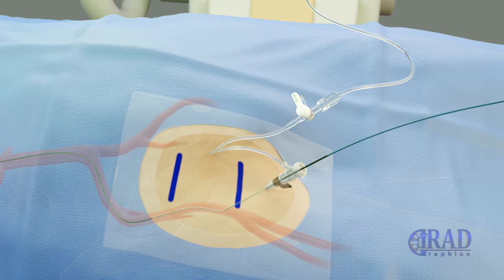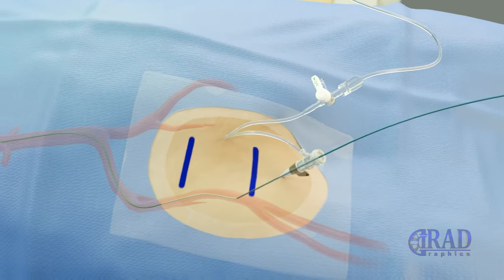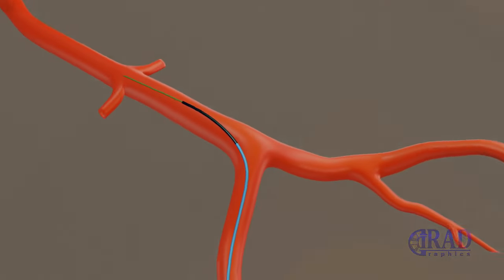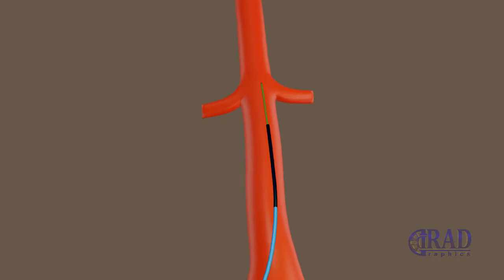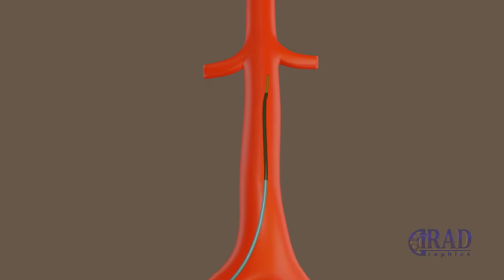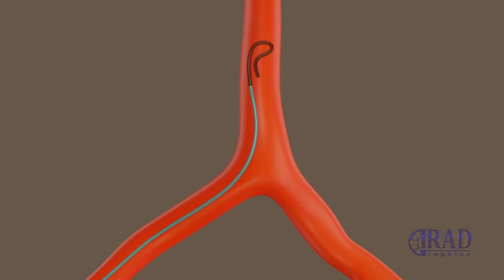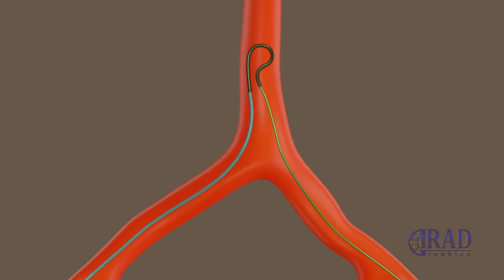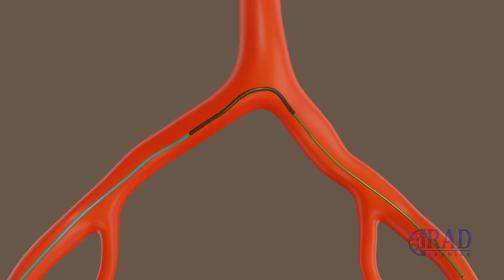A curved catheter is advanced over the wire through the sheath into the lower aorta. Subsequently, the tip is formed by pulling back the wire. Then, the wire is re-advanced, and this combination is used to select the contralateral common iliac artery.